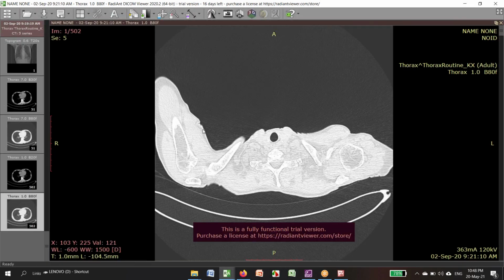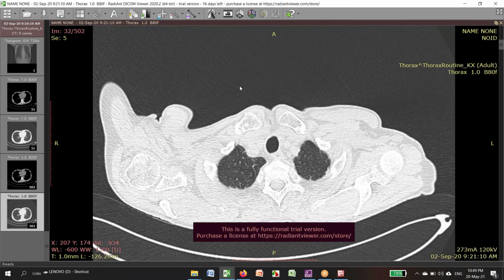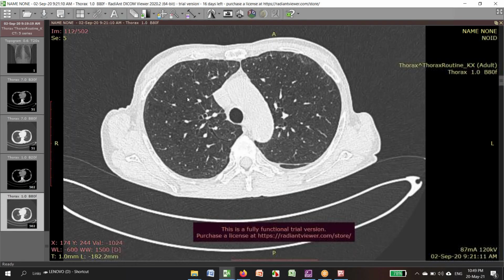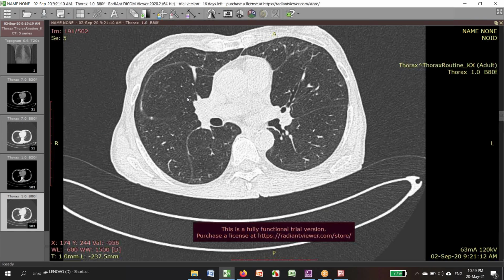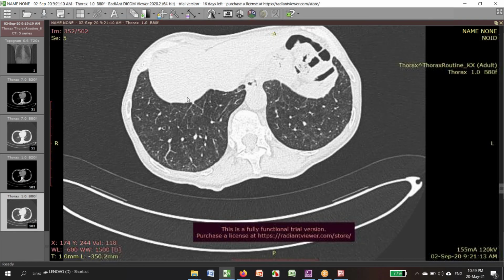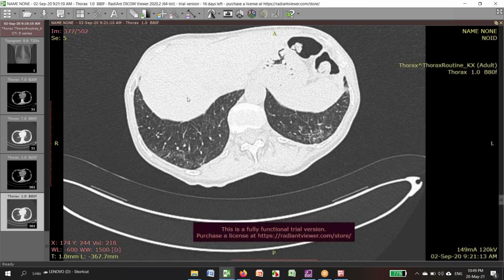And this is the CT afterwards. I think, because I have anonymized the case, it's about 4 to 6 months after, if I remember correctly. And so you see this dramatic improvement. In this case, no steroids were given or any other immunomodulation. And the findings are almost gone. There's almost a complete resolution.